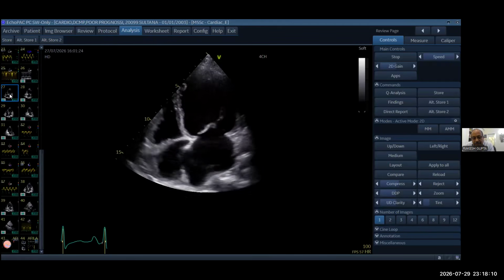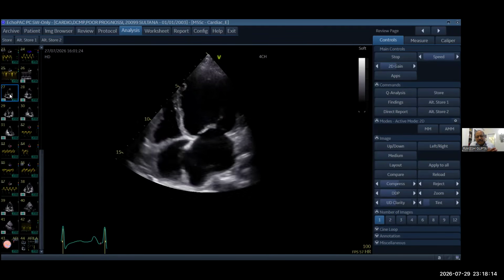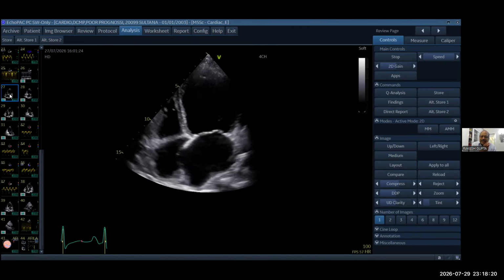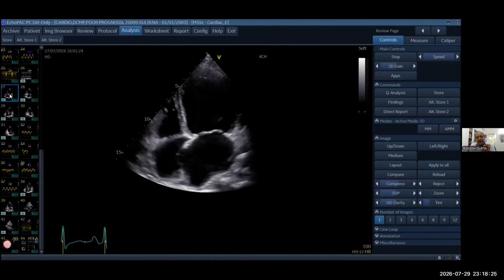And same thing, once you treat this patient, go back and see the IVC next day. Look, go back and see her diastolic function. Look and go back and see her TR gradients. Obviously, they'll start reverting to normal.